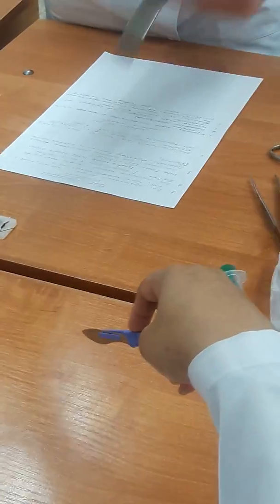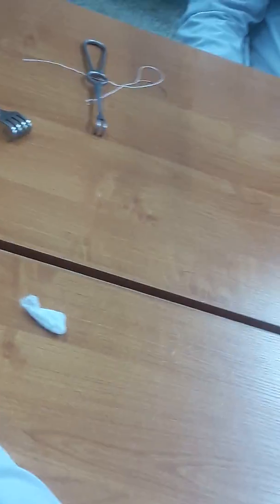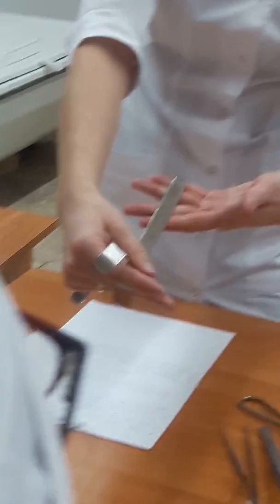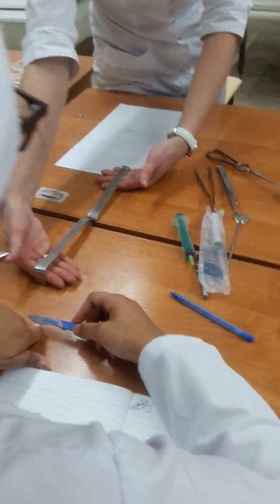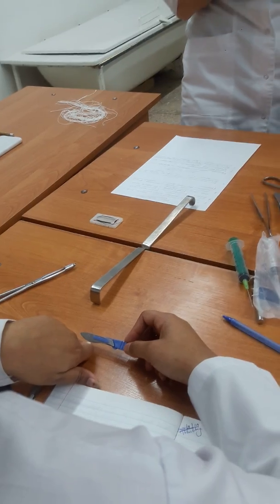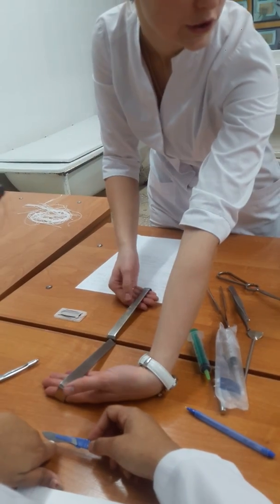If I put it this way, he cuts my hands. So I will do it this way. If you have a plain retractor, your palm should be here under the hook, and here your fingers stop, and from this side this way. This is the right position of the plain hooks in your hands. This is the right position of the hand if I'm an assistant and she's a surgeon. If you are left-handed, it will be more comfortable to do it this way.